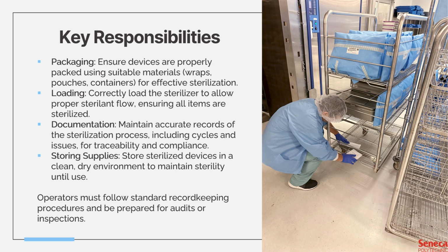So this one is a bit too tight, and you could see this person even has another level down in the bottom, so they could just put the rigid containers down there too. Oh, and if you see here, they stacked the containers like this. This is actually a viable option for steam sterilization, which I would have to say I would never do, but some hospitals actually allow stacking like this because if you could see the corrugated metal here with holes and such, the steam could actually penetrate through that to the bottom tray or instrument container. But with all the space, I would just say spread things out properly, right? There's really no need to overcrowd like this. This is a bit much.